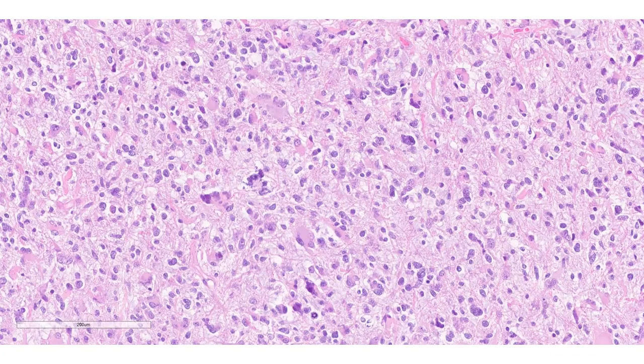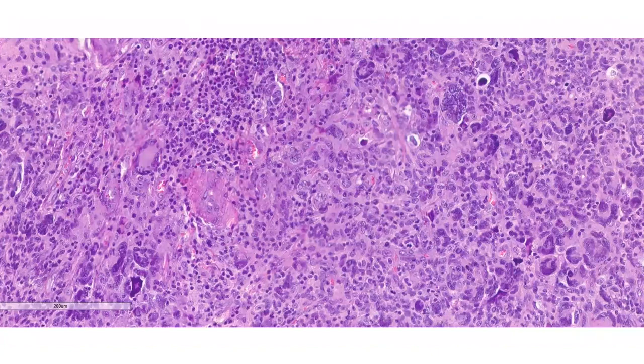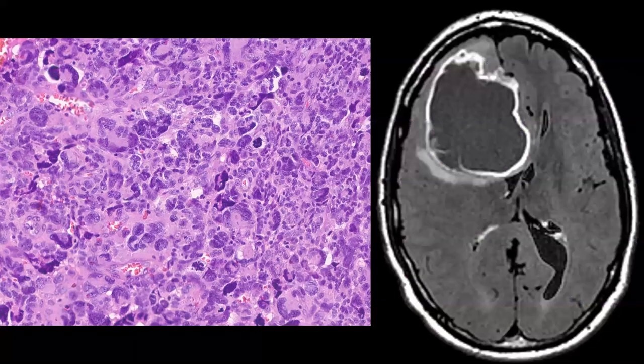I got several panels, just take that in. Here's another area, one more. Okay, all right, would someone like to unmute and give me a diagnosis, or what is at the top of your differential diagnosis? Cystic glioblastoma. Yes, cystic glioblastoma, absolutely. IDH mutant or IDH wild type? IDH wild type. Okay, absolutely.